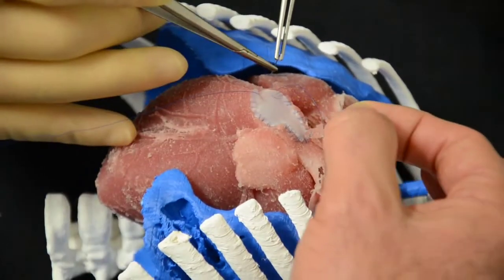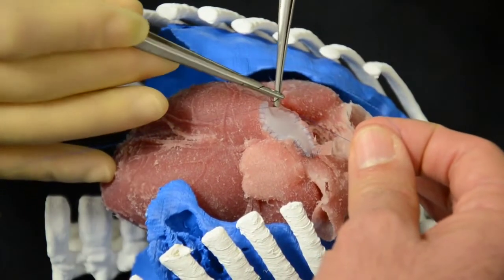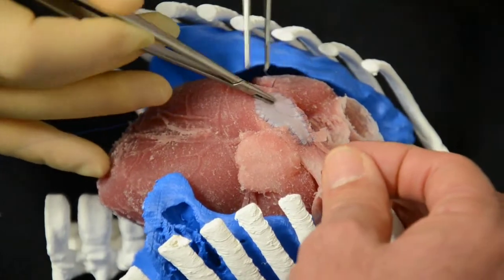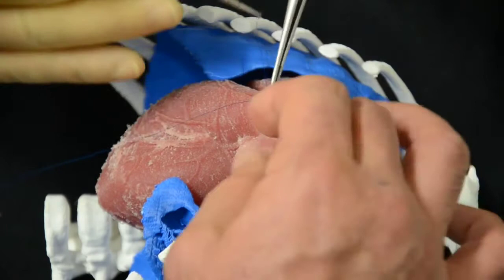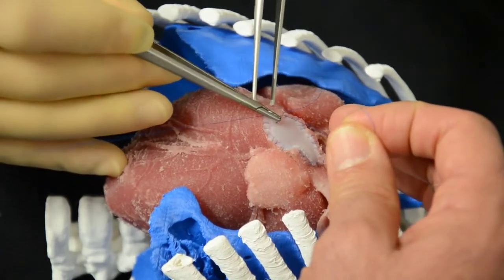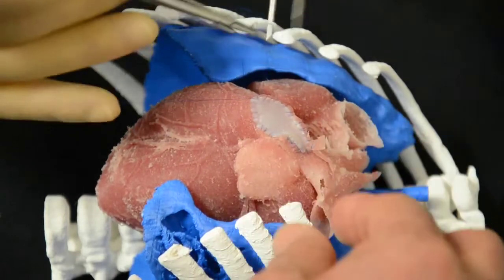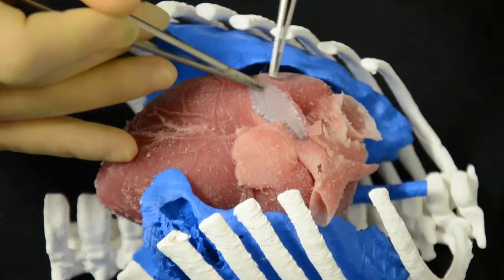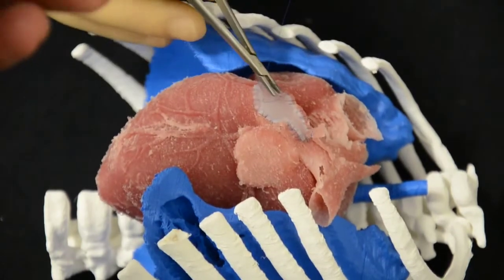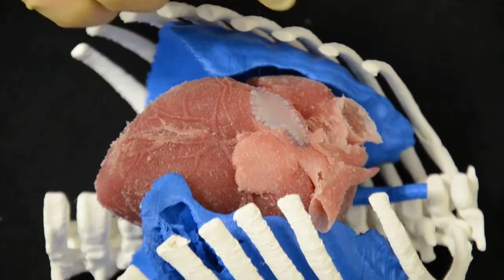In real life, this is all full of blood — blood everywhere. When you finish this procedure, this part of the patch, despite the pressure inside, will probably be about 100 millimeters of mercury — a high pressure on blood inside. The stitches have to be incredibly accurate so there is no leak of blood anywhere. There cannot be any holes. When you have a tiny cut in your skin, you bleed — this is the same, or worse. It needs to be incredibly accurate, with the correct amount of tension. If you follow the suture incorrectly, the suture will be loose and they will leak in between.